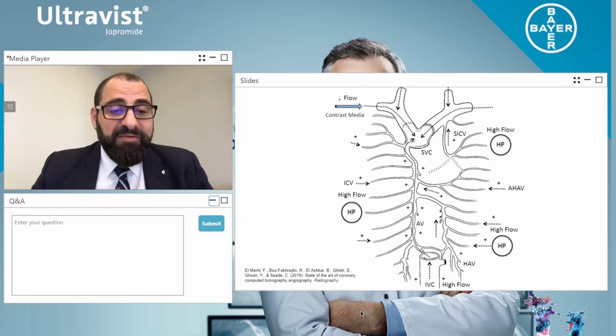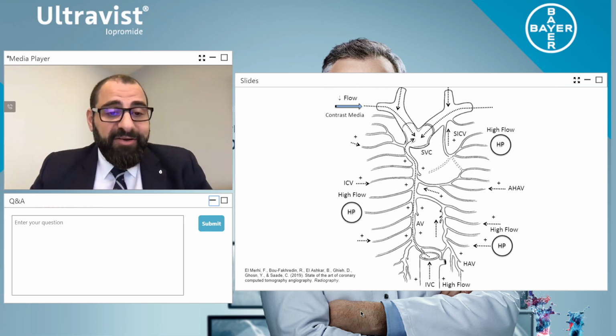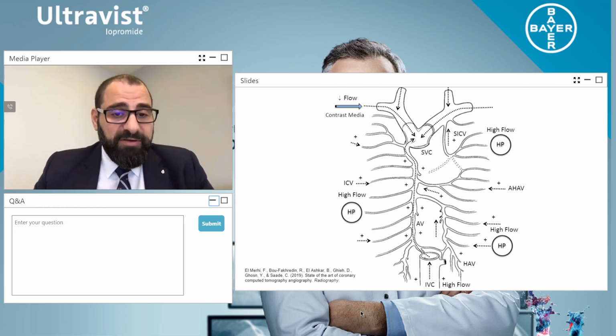So what's happened now is you've actually held your breath for 10 seconds, the heart rate doesn't go up, and blood flow is still moving normally because we're not raising the intrathoracic pressure or the pressure within our lungs, because our body doesn't think we're going to have to run away from something using the fight or flight response.